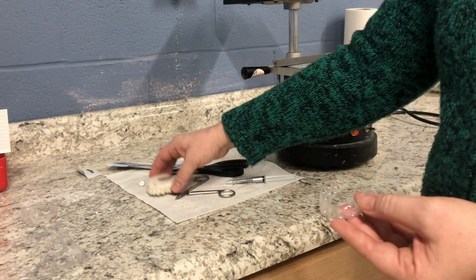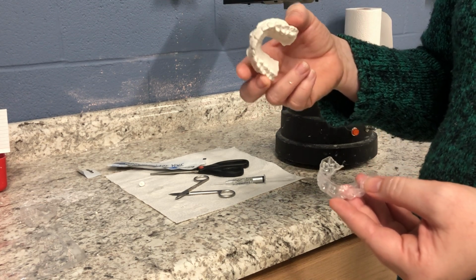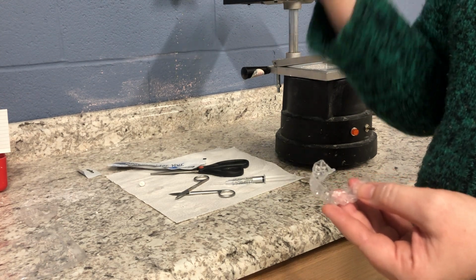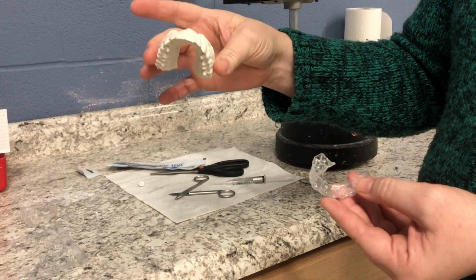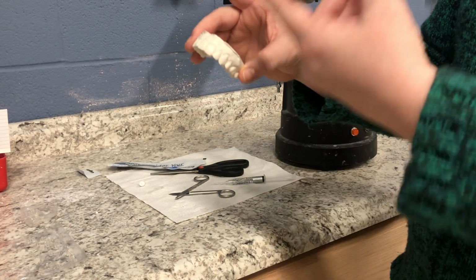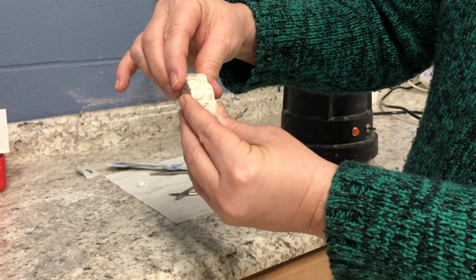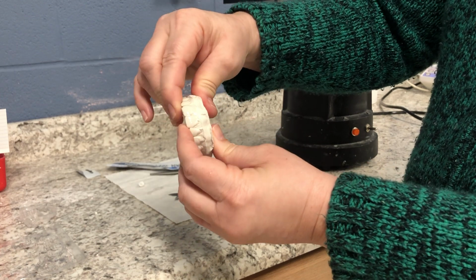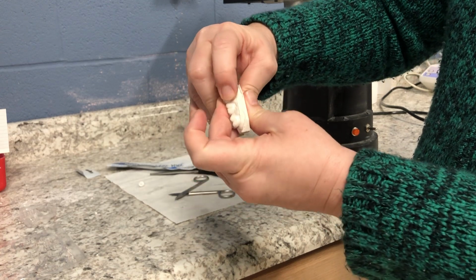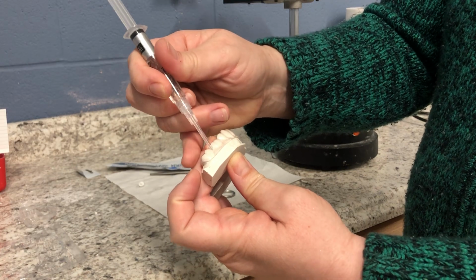Then you instruct your patient, brush your teeth, swish out with water really good, and then kind of swallow, get all the water out of your mouth, suck in a little bit of air so that the gel sits directly on the teeth and not on top of saliva. Once you put this in, you see how it kind of disperses.